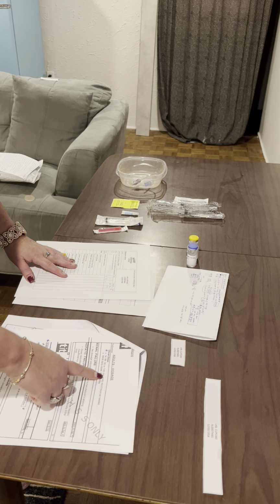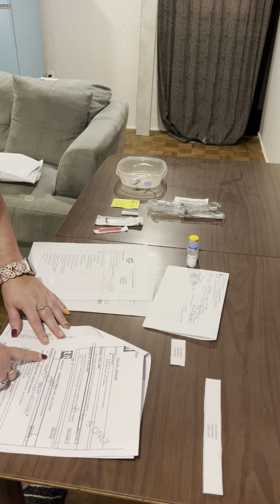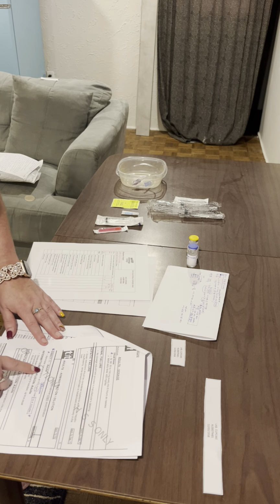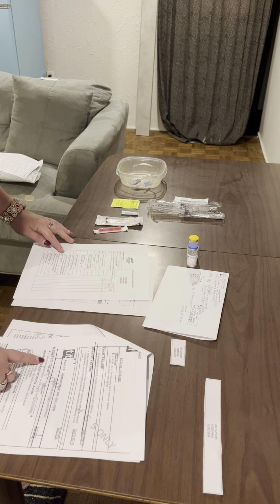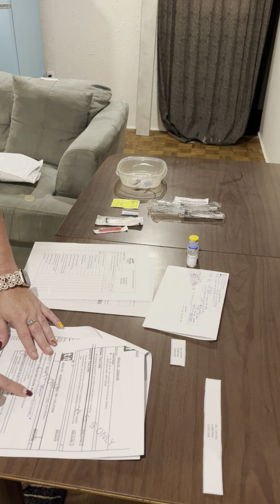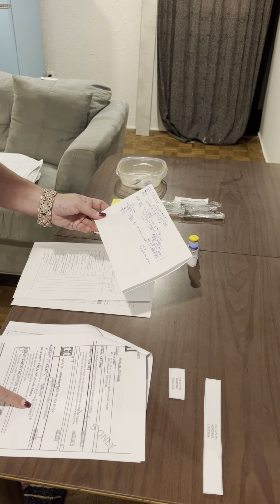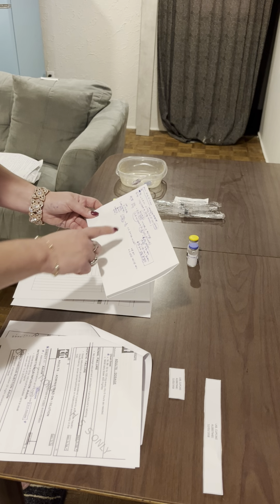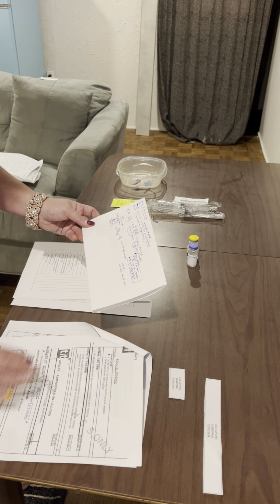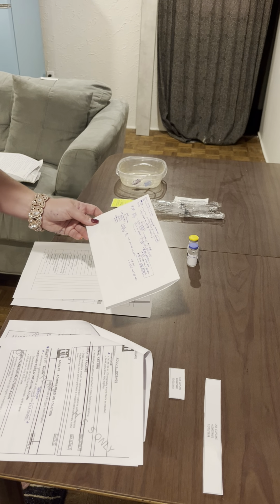But this is not a normal dose. It's to be given direct IV. So we have to skip down to the direct IV here, and we have to look at the directions there. And it says, we'll double check, administer concentrations up to 5 milligrams per mil over 2 to 4 minutes. So we'll look at our med math, and that agrees with what we figured out. We figured out our total to be 5 mils. We knew we were going to give it over 2 to 4 minutes. We chose 2. So our med math agrees with this, and we're good to go.